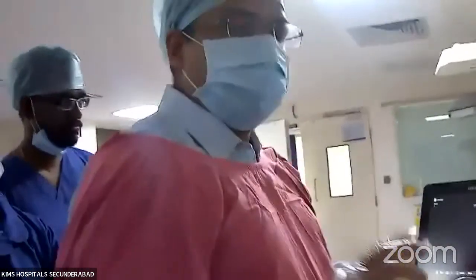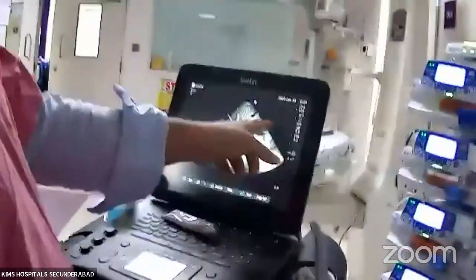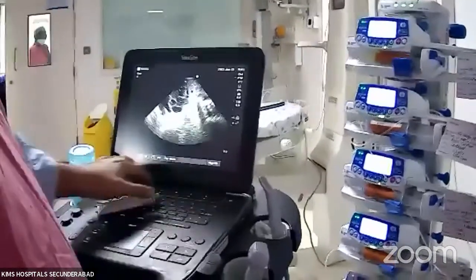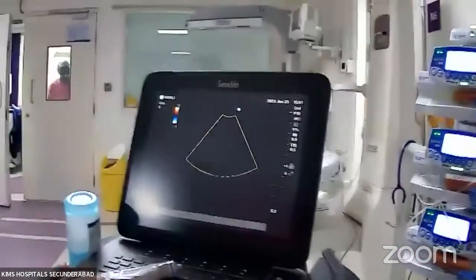So like that, you can come to know whether the IVC is dilated, whether the IVC is connected normally or not, or whether the UVC is rightly placed or not. With the changes, but this marker should always be on the left side. And for upper and lower, you have to change like this, and then this is the color.